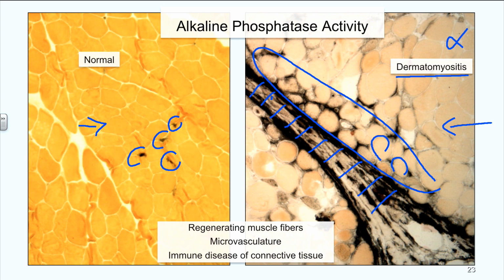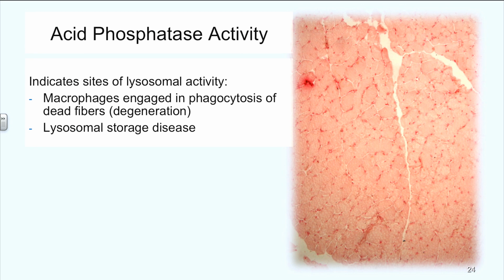This alkaline phosphatase reactivity shows not only the intensity of the disease in the skeletal muscle, but also shows the potential for turnover. Is there any potential, is there any regenerative features in this? Because sometimes regenerative fibers can actually show up on alkaline phosphatase as well. Now, for regeneration, you have to have degeneration, right? And that's what we assess with acid phosphatase activity.